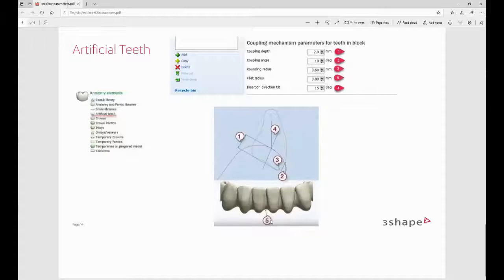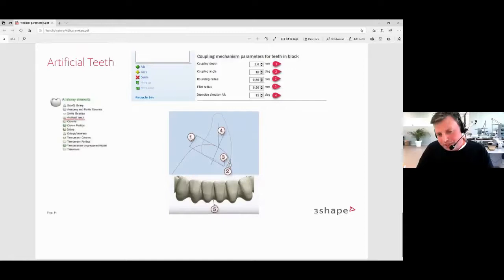Another question: what is coupling angle? Herman shares his screen to show: the coupling angle is the angle between the buccal side of the teeth and the angle with the gingiva — the angle at which the gingiva meets the tooth at the coupling interface.